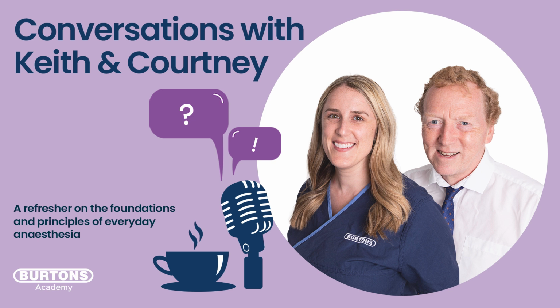So they breathe out into that system. So about 10 to 15 minutes, we have this high flow of oxygen going into our circle system. And of course, in anesthesia, we love to put a number on things, just to make us feel a little bit better. So we often put it on about 100 mils per kilogram per minute. That's, if you look in the textbook, the recommendation. And I think, once again, that is just a calculation for comfort.